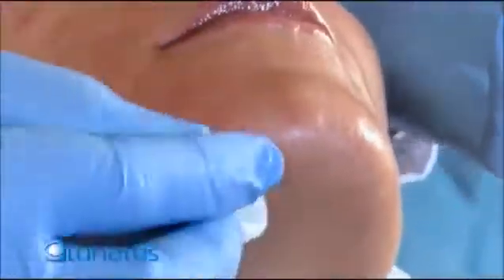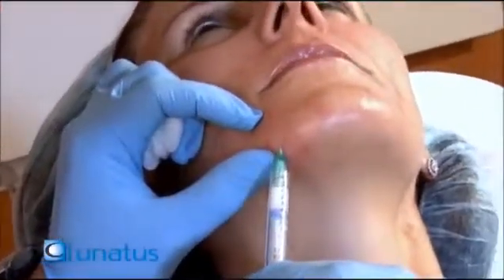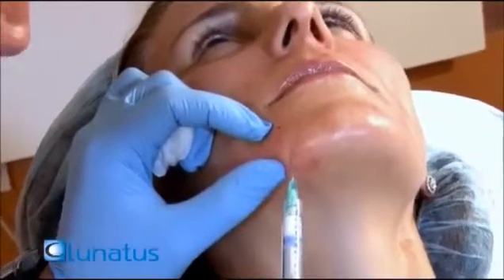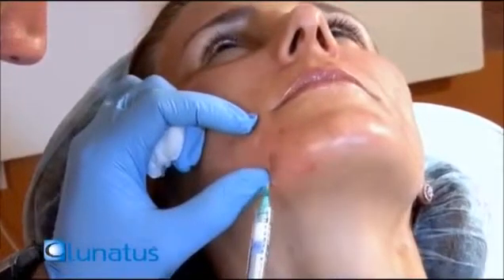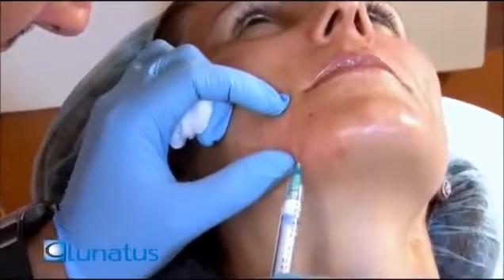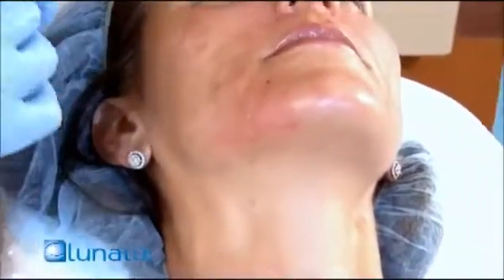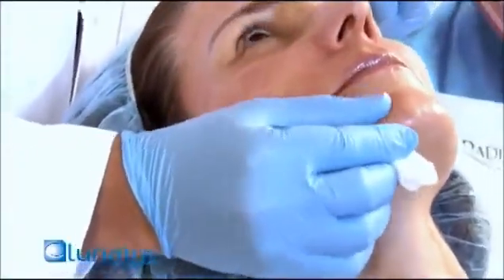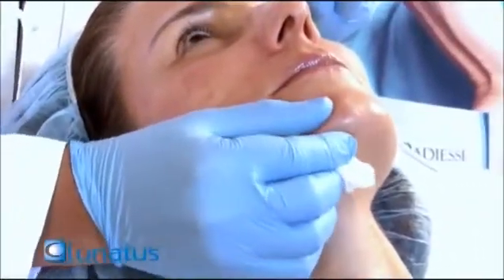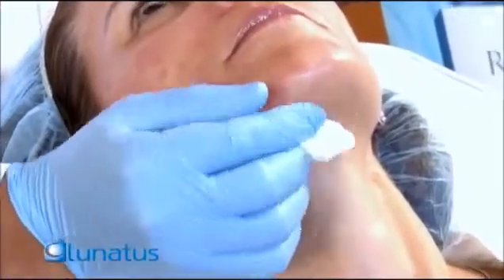With the chin I like using the cross-hatch technique — I've injected parallel lines and then cross-hatching. Cross-hatching gives us much more volume and is mainly used in the cheek area and also in the chin area. I think that is enough for her on one side. We've injected about one full ml — one cc — mainly on the right side.